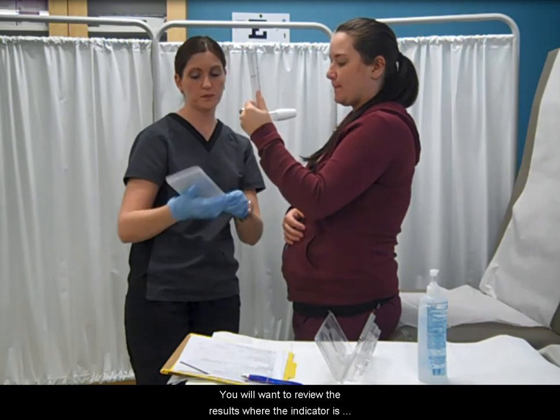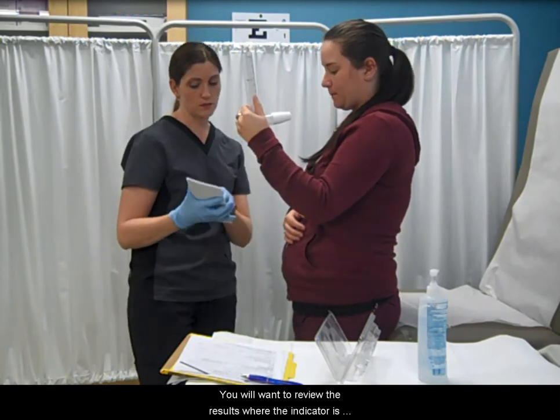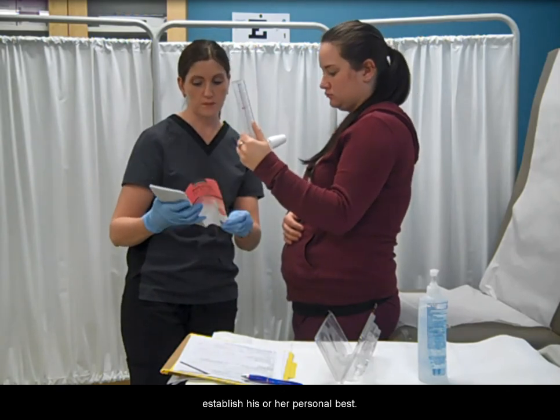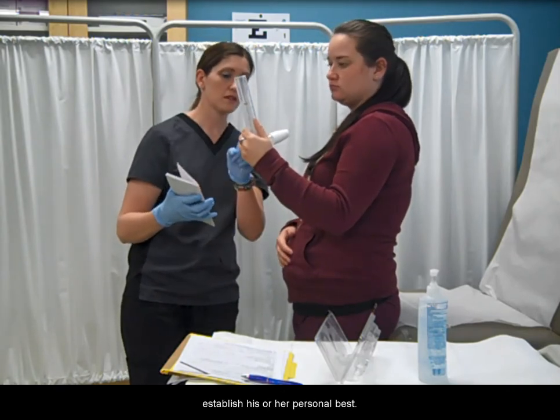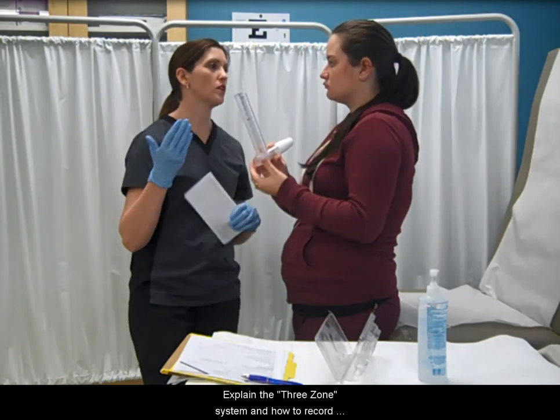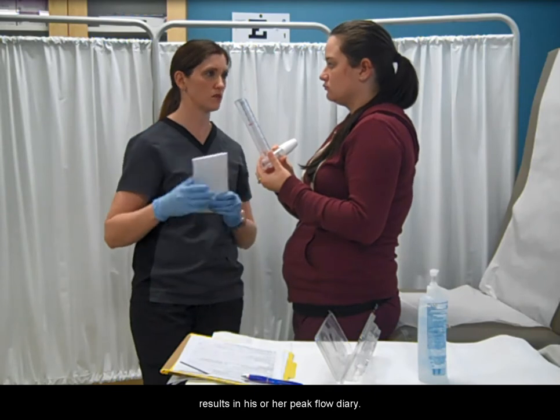You will want to review the results where the indicator is at. Explain to the patient how to establish his or her personal best. Explain the three zone system and how to record results in his or her peak flow diary.